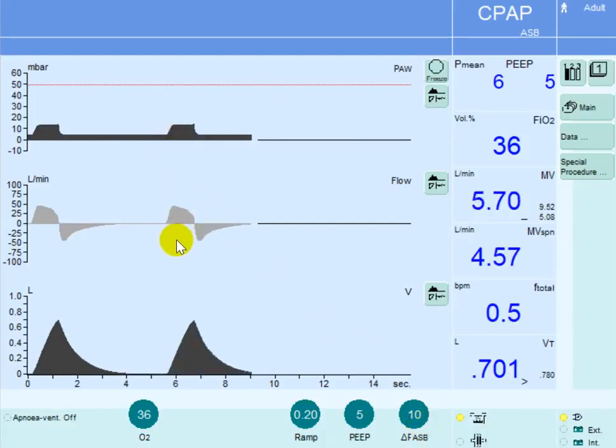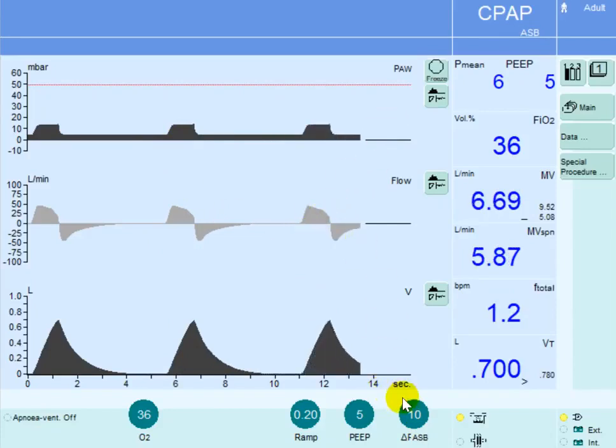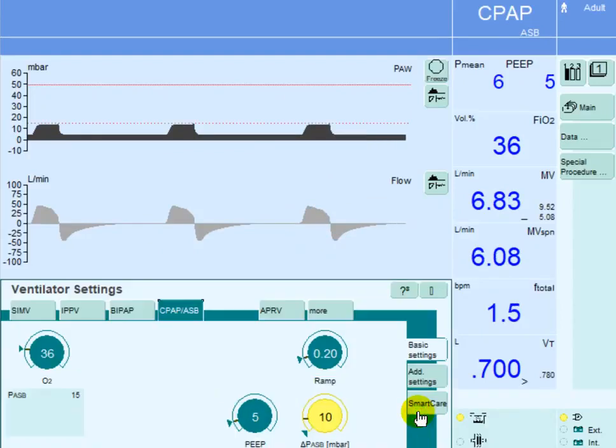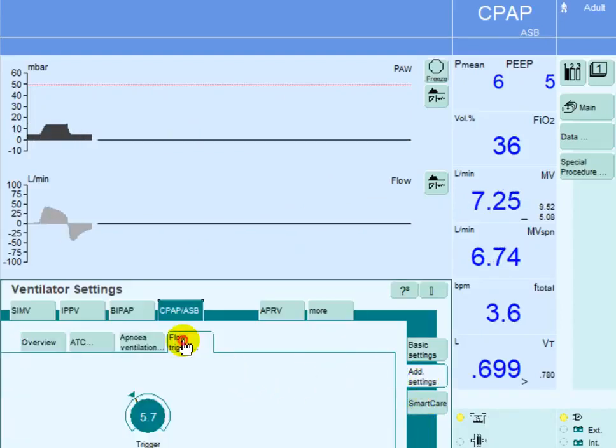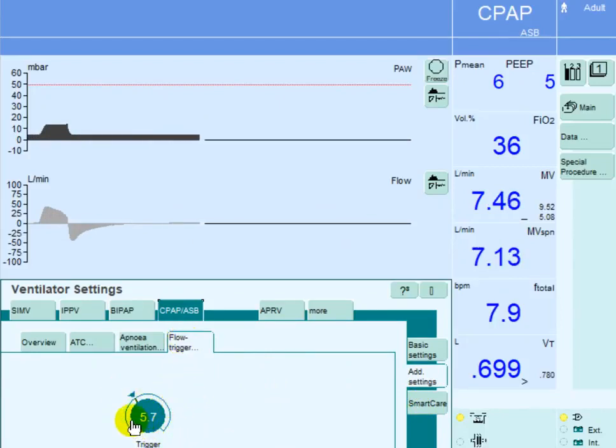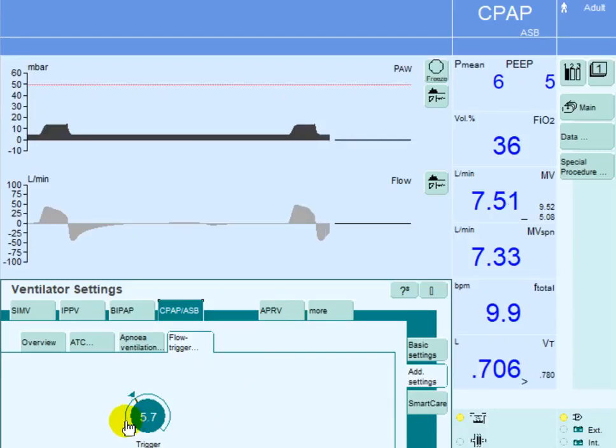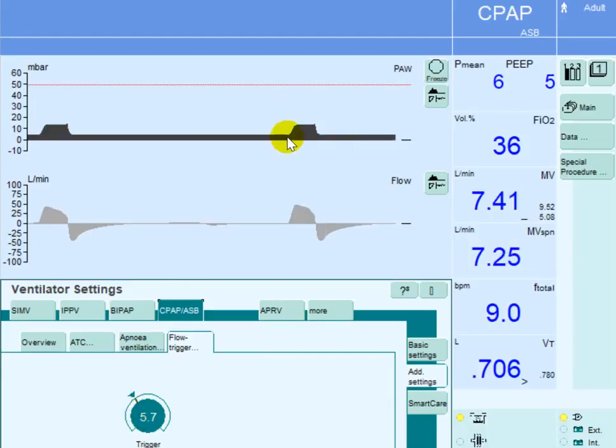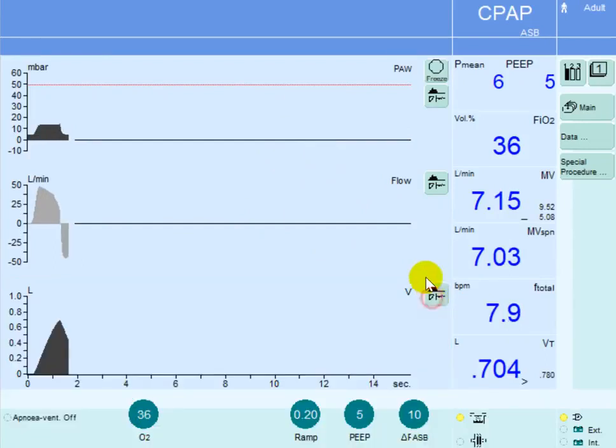However, the patient has to reach a certain value set by the physician. You can go to additional settings, go to flow trigger, and you can see that the patient has to generate at least 5.7 liters per minute of inspiratory flow before he's able to trigger the ventilator to deliver that pressure support of 10 centimeters of water.